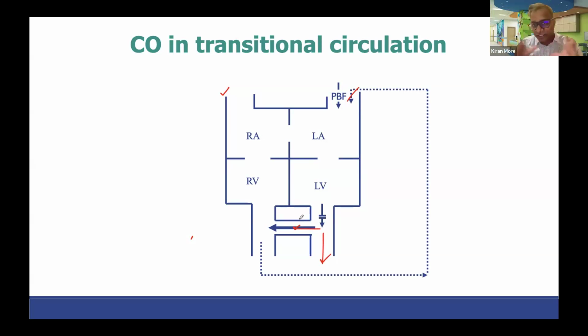So again, your interpretation might change, and that's why you need to do the full comprehensive echo to make an interpretation and write down all the parameters, and we can discuss during the workshop, and then make an interpretation about what's going on with the baby.